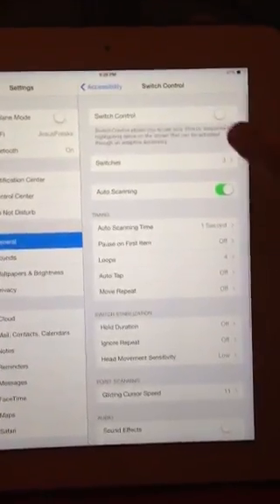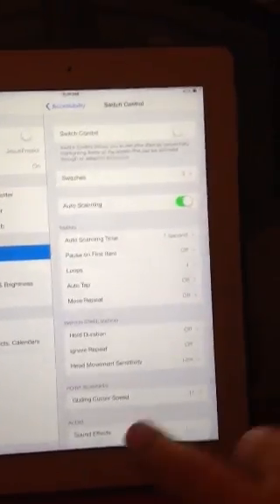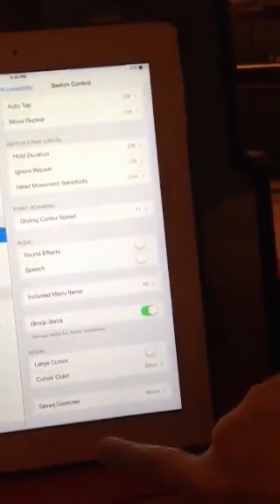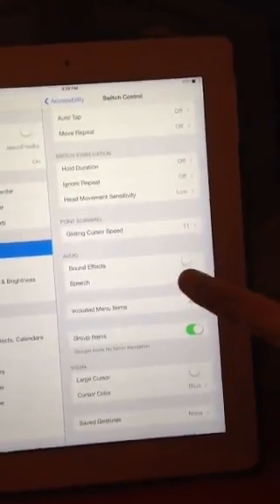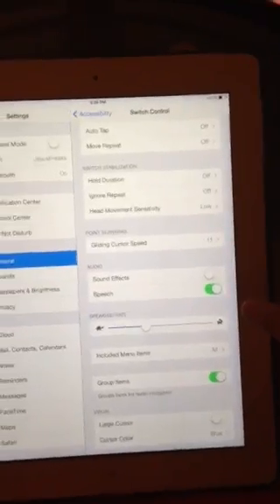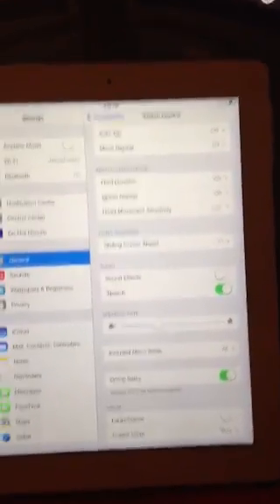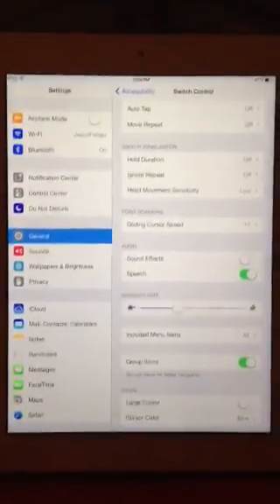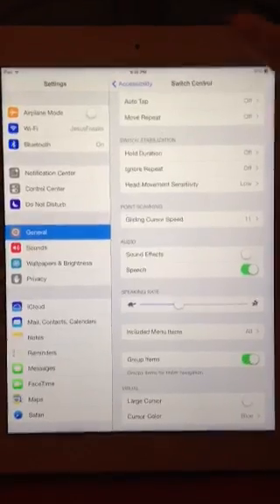So we have three switches set up. I'm also going to turn Speech on — I believe this will tell me every time it moves what it's highlighting, so that if you have someone who is visually impaired and can't see each of the apps or icons, they would be able to hear them instead.